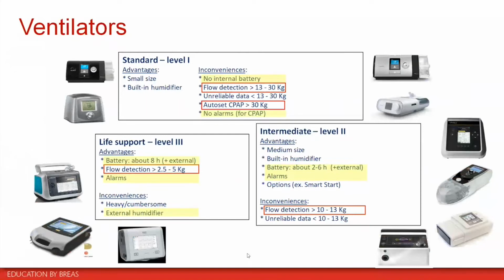the positive points. And it is important to ask the manufacturer if you have some doubts, and to try to understand how they function, what are the different options before you start to use them on the patient, especially when this is new models of ventilator. So it is important to take the time to understand all the functions of these ventilators.